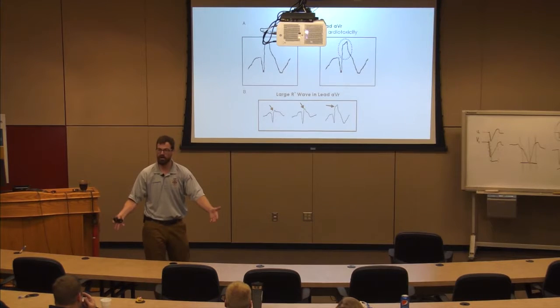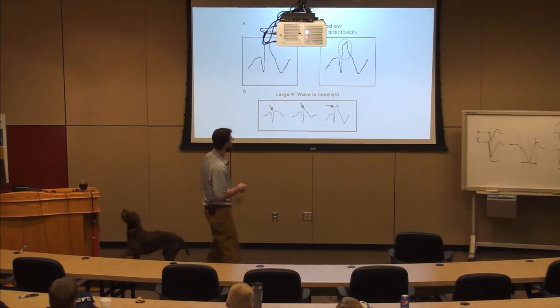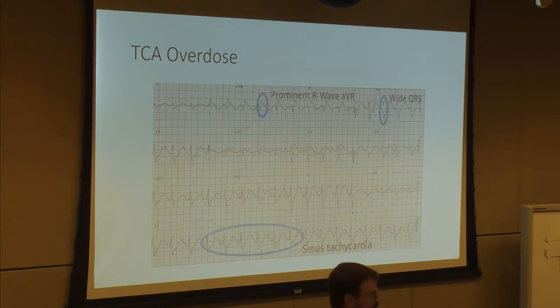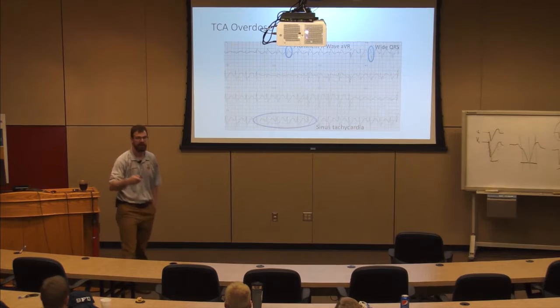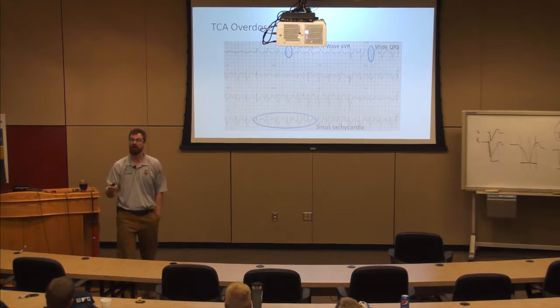So in the clinical context of potential overdose, I'm going to use a 12-lead, and I'm going to look specifically: do I have a wide QRS? And if I do, is it bizarre, and do I have a prominent R wave? Sodium channel blockade, okay? Does that make sense? Those are the features of sodium channel blockade or tricyclic, and we treat that in the pre-hospital setting, right? We treat that with bicarb.